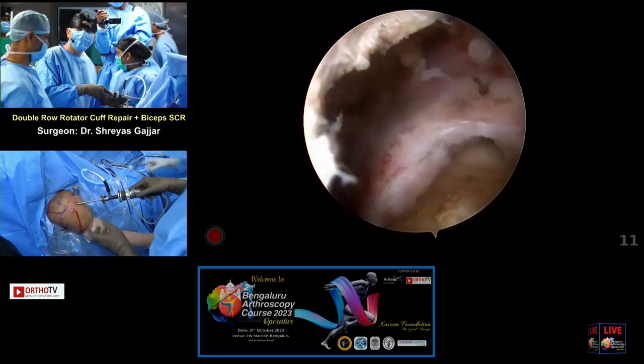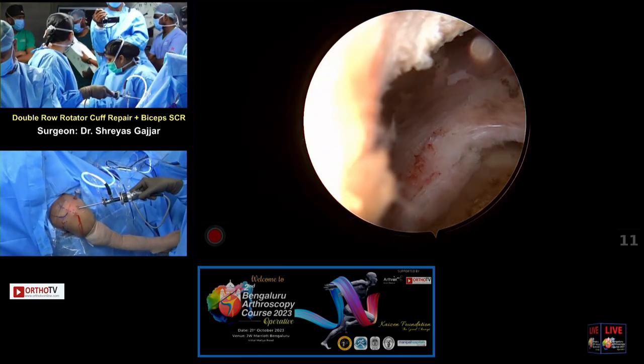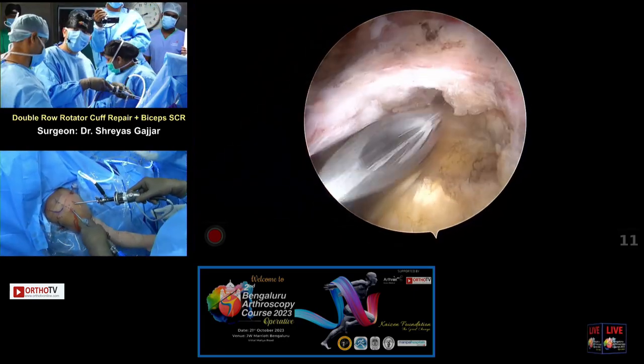For the delegates, you know, this Shaver, please, Rohit. The anchor which he's going to use now, the swivel lock, is quite a simplified anchor. When you do not have a good partner to assist you, I think this is one of the best anchors when you are starting your career.